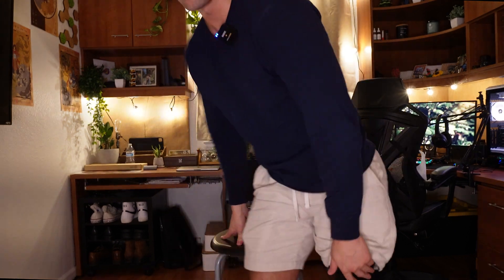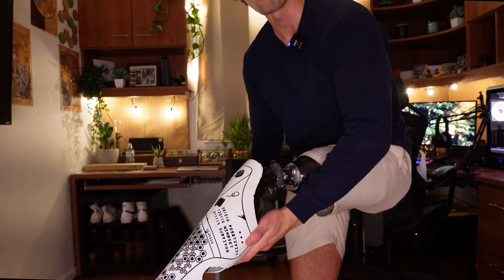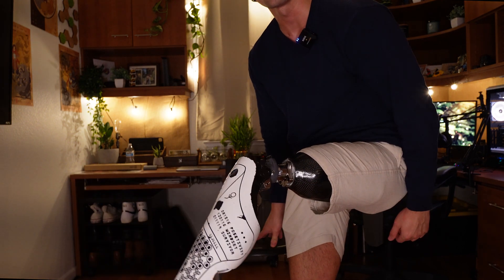The microprocessor knee is battery powered and has a computer chip in the actual knee itself. It detects how fast you move, how much weight you put on it, and it moves your prosthetic for you. Every time I raise my foot, my prosthetic knows I'm raising my leg and slowly moves it down. With a mechanical knee, it kind of just falls. Those are the main two differences.